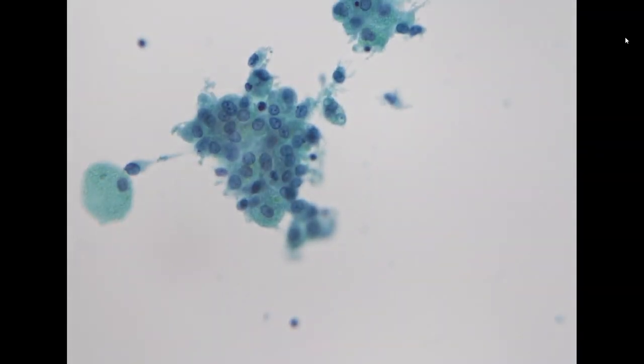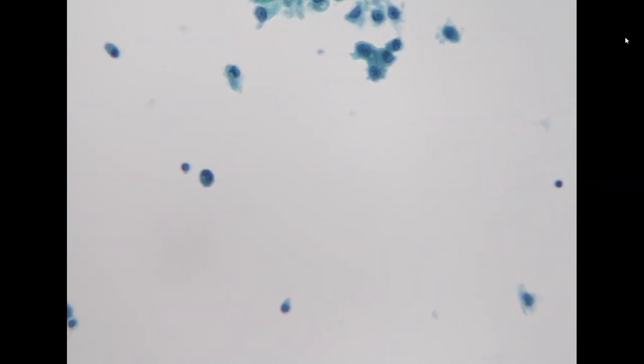But you have to pay attention to the character of the cytoplasm. You see granularity and small bubbles inside the cytoplasm, foamy type. So these are all histiocytes, not epithelial cells. We didn't see epithelial cells, we only see histiocytes.